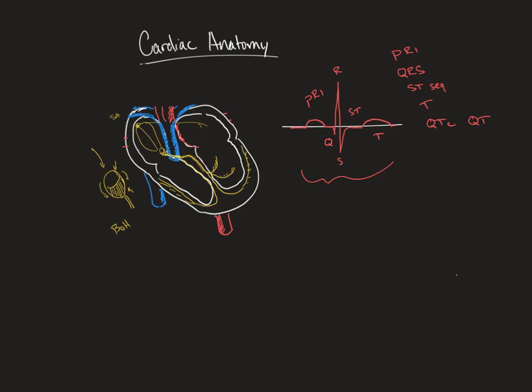pathologies. So with PRI, in the basic arrhythmia, 4 lead, 3 lead, you're going to be looking at duration. And the PRI is either going to be constant and normal, constant and long, constant and short, or varied. And the variance in the PRI you'll observe in certain blocks is going to dictate what type of block you have.